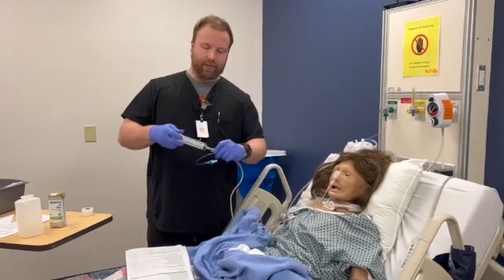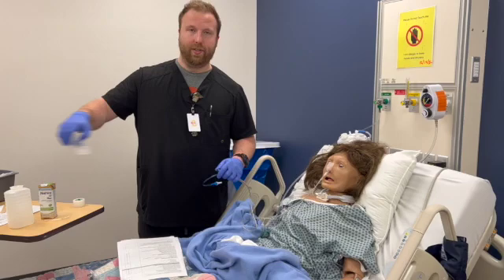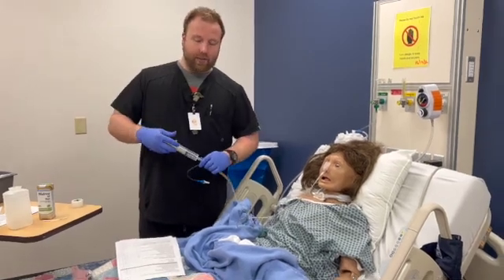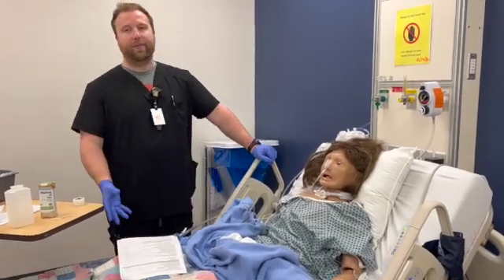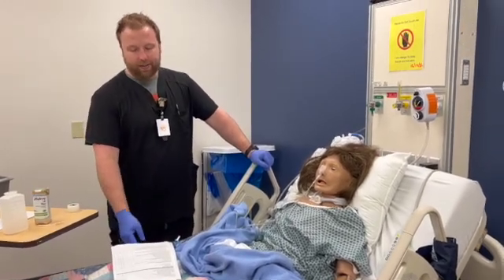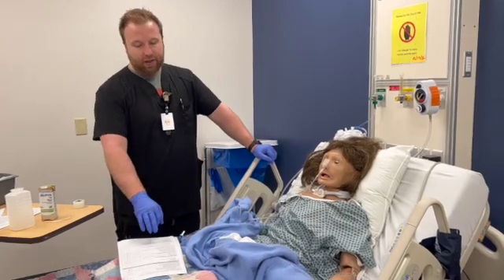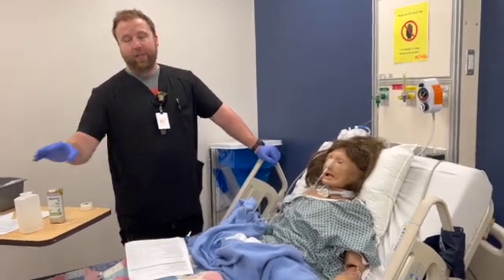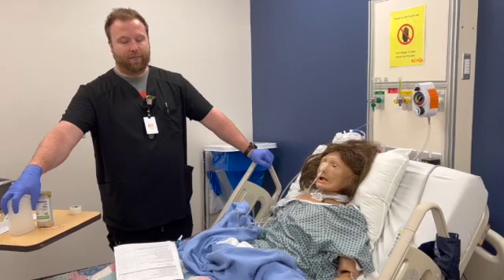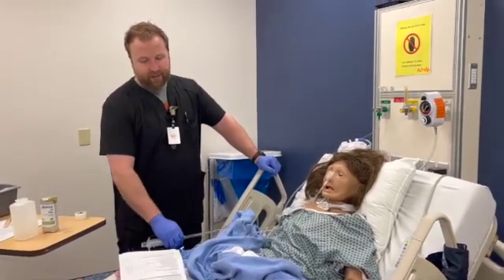The way you do this is just pull all this back out and you will measure all of it. If it's not your first tube feeding, there may be an excessive amount in there due to slow GI motility, the patient's not emptying, or maybe you're just giving too much food. Therefore, if we have too much, we would have to call the provider and let them know. They would probably reduce the feeding.